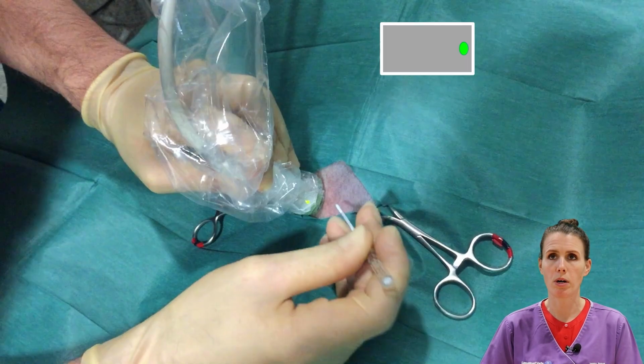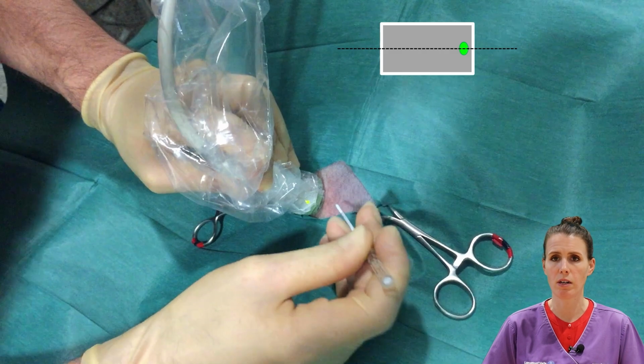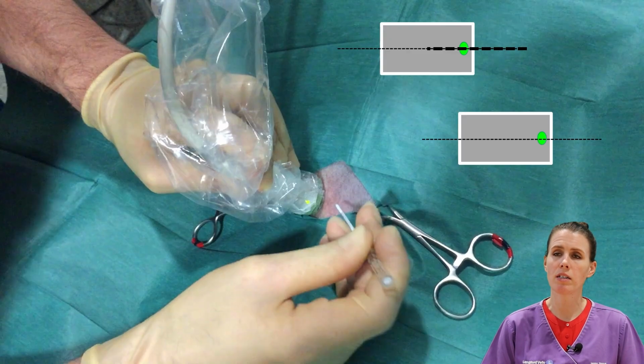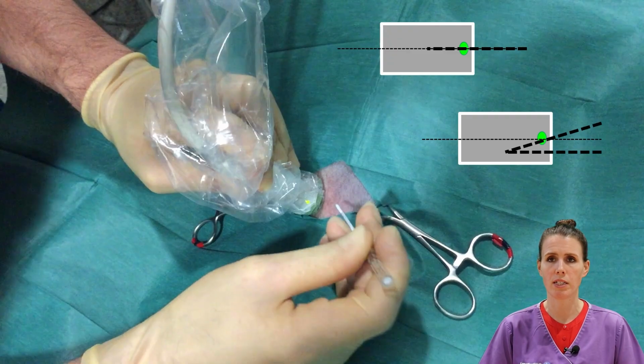So if we've got our ultrasound probe, this is meant to be the footprint of the ultrasound probe, and we will see anything that appears in the midline of the ultrasound probe, which means that our needle has to go in perfectly in line with this midline and remain perfectly in line with the midline of the footprint of the ultrasound probe. So what we can't do is cross the midline, because we will perhaps see the needle for the small point it crosses the midline, but not anywhere else on the needle tract. And also, if we go parallel to the midline, we won't see our needle as well.